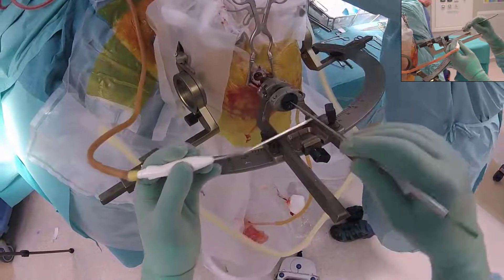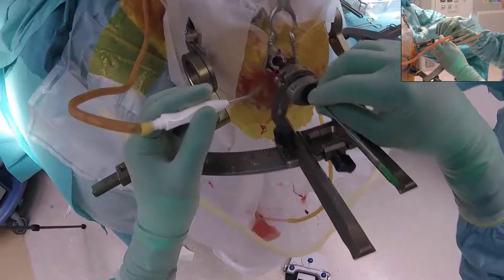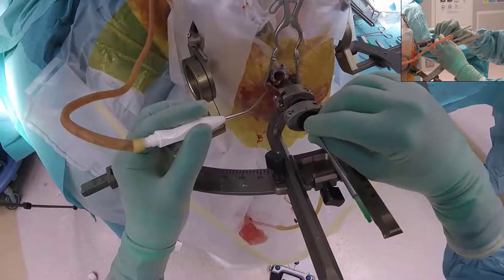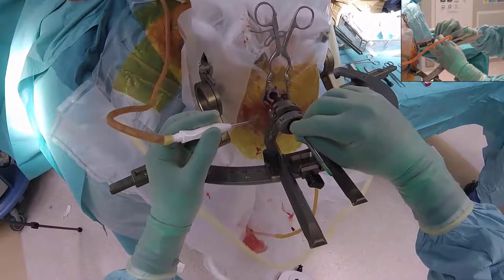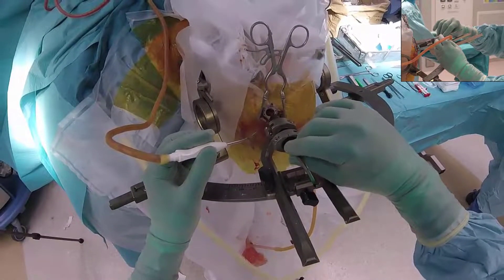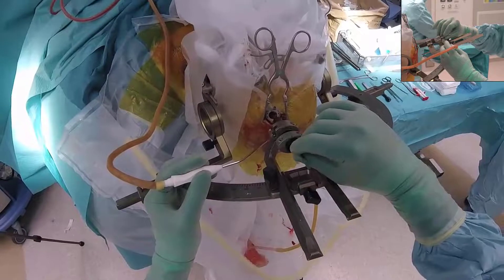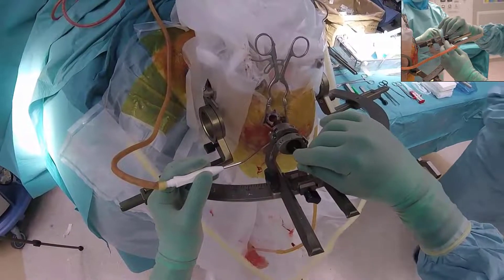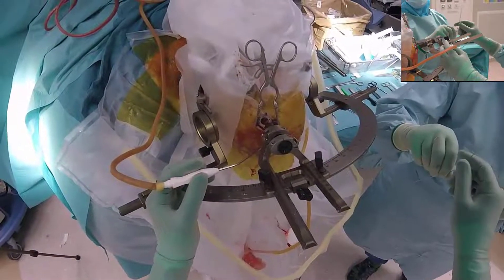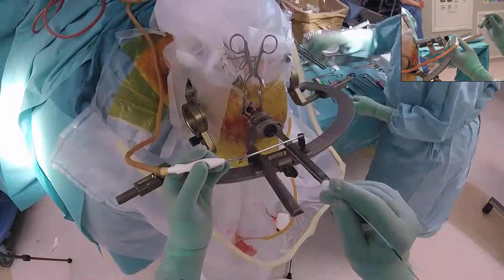The DBS electrode can, as you know, be implanted using a cannula. But especially the removal of the cannula will add several minutes to the procedure. A much faster way is to make a channel for the DBS electrode by using a radiofrequency electrode, as we see in this video. When you introduce the DBS electrode, it will follow the preformed channel and it will not deviate from this. This is the method we have used in about 1400 DBS implantations without problems.